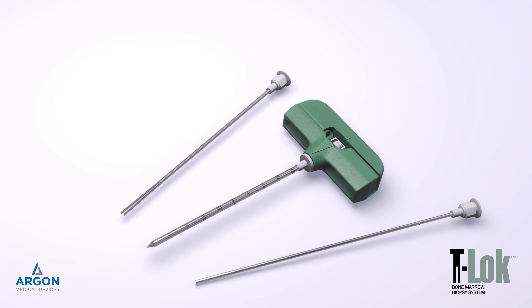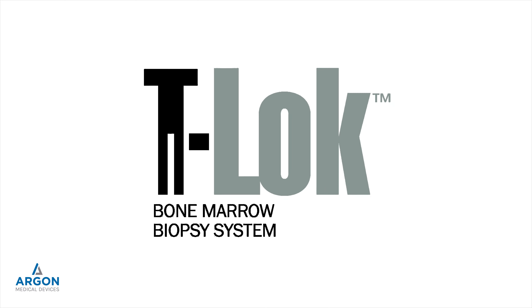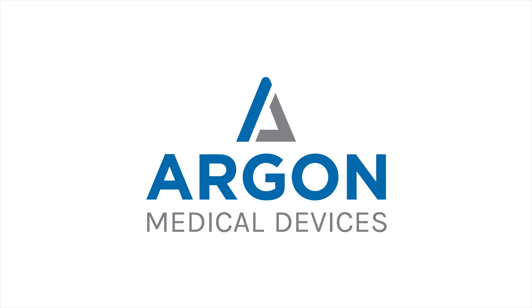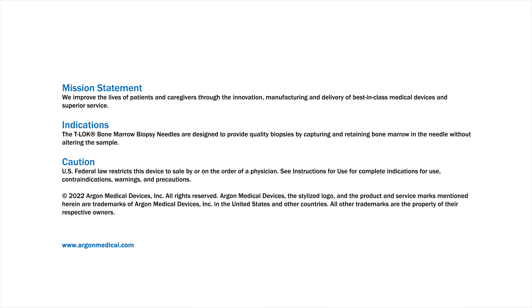The T-Lock Bone Marrow Biopsy System is designed to provide quality biopsies by capturing and retaining bone marrow in the needle without altering the sample — the T-Lock Bone Marrow Biopsy System, providing the precision you need.